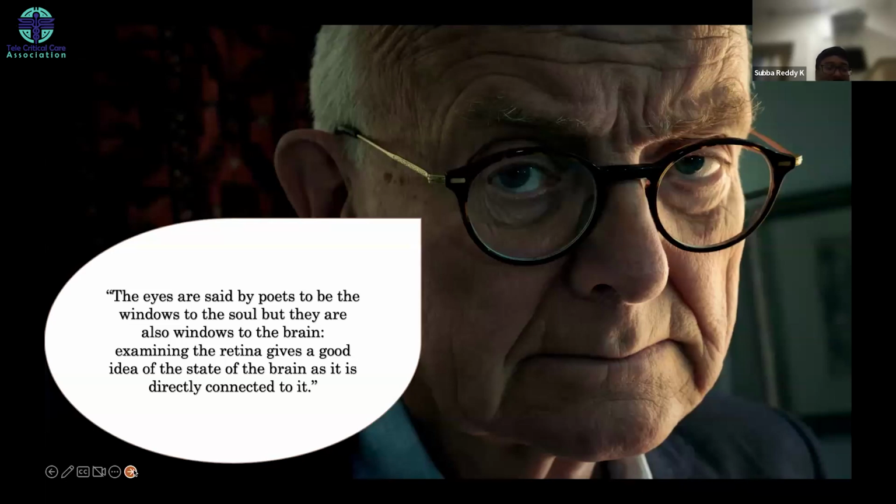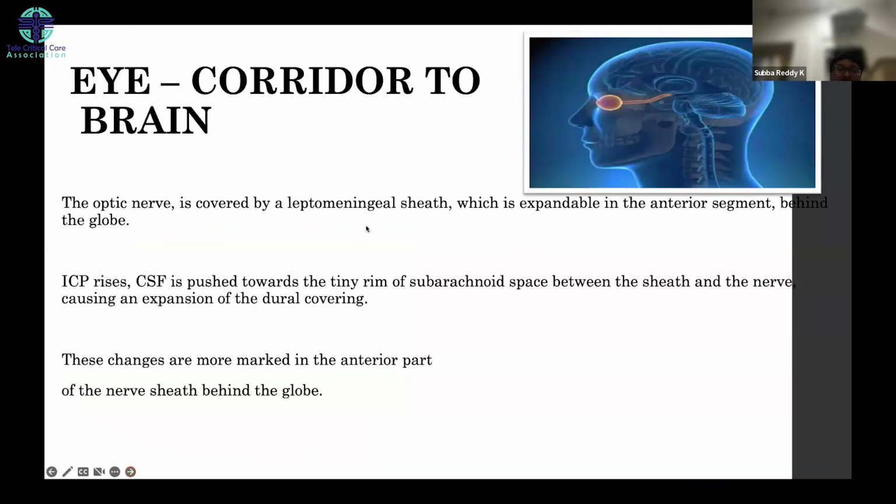Examining the retina gives a good idea of the state of the brain as it is directly connected to it. So we basically use the eyes to insonate and look at the optic nerve sheath diameter as one of the modalities to measure ICP in the intensive care unit.